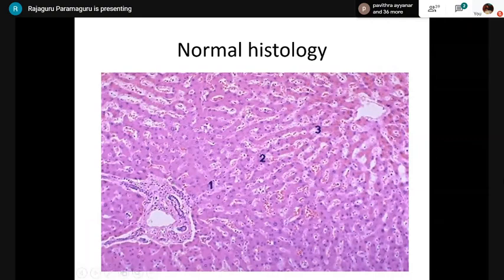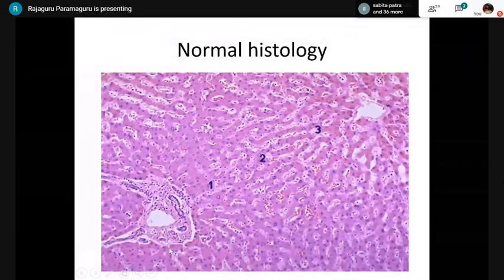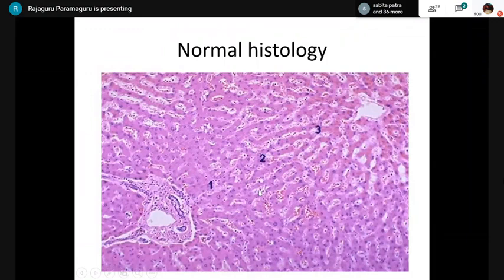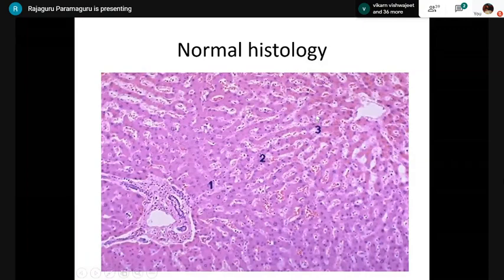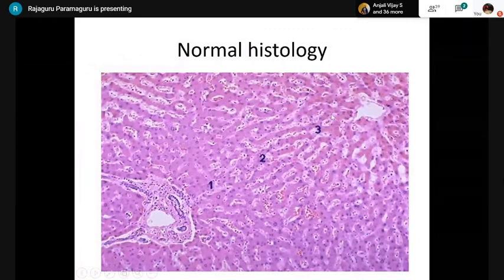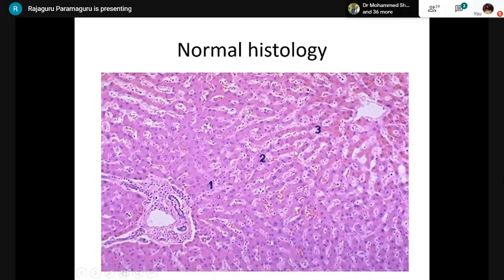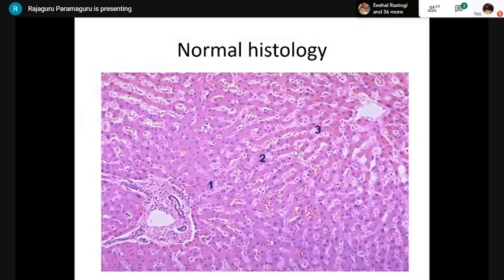The limiting plate is the layer of hepatocytes immediately surrounding the portal tract. Between hepatocytes you see the sinusoids, and here is the terminal hepatic venule. Brown staining of hepatocytes represents lipofuscin — a degenerative pigment. The sinusoidal spaces are lined by specialized endothelial cells that, unlike normal endothelial cells, are not stained with CD31 or CD34.